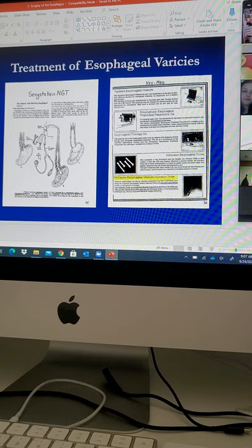We have a couple of ports here. One goes through the gastric balloon. One port goes through the suction, because you're going to have bleeding there. You have to suck the juices which build up in the stomach, and you have to suck the blood, right? So therefore, this is the suction in the stomach at the bottom where I'm pointing out. And then you have the esophageal balloon connected. So we have a clamp for the operation, which we can clamp.